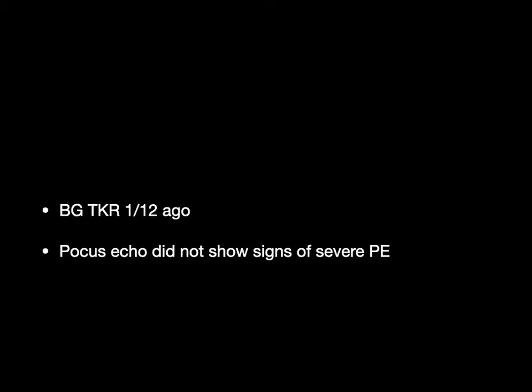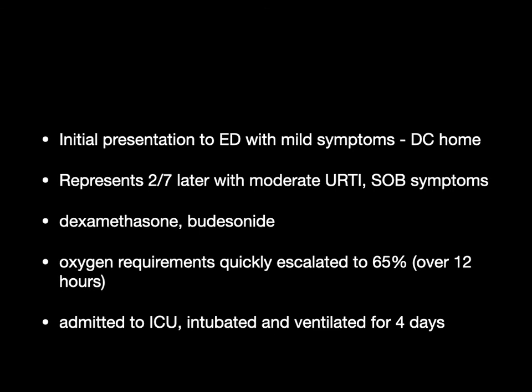So he had a knee replacement a month ago, and then represented with shortness of breath. So in the differentials we had a PE in there as well with the recent knee surgery and immobility. So we echoed him as well. There were no echo signs of a pulmonary embolus, or at least not a large pulmonary embolus. But we did see quite significant changes with his lungs.